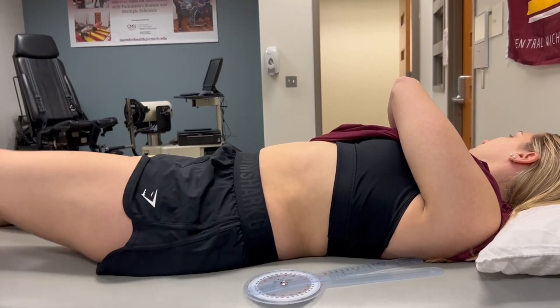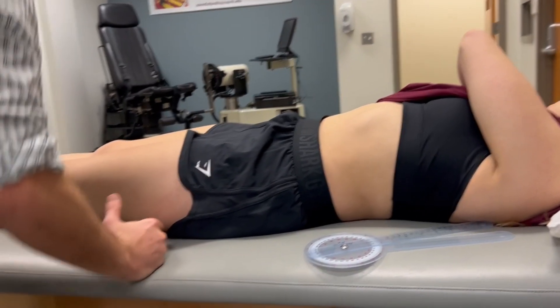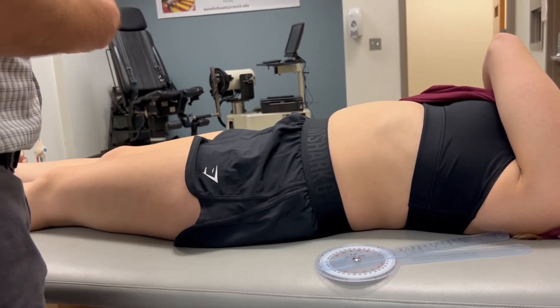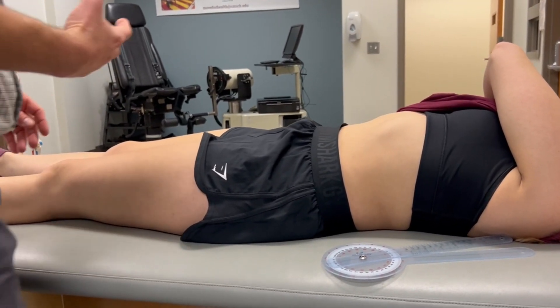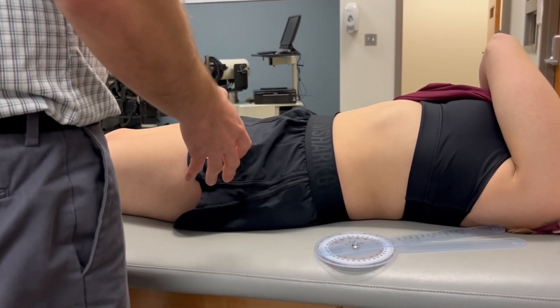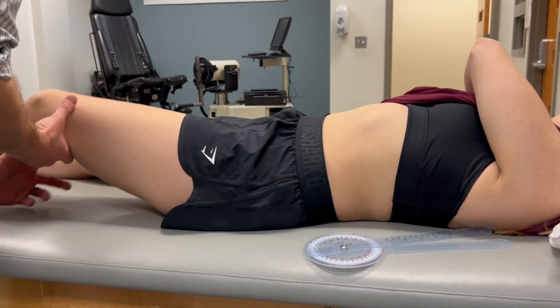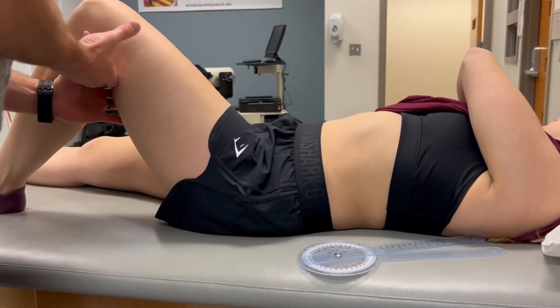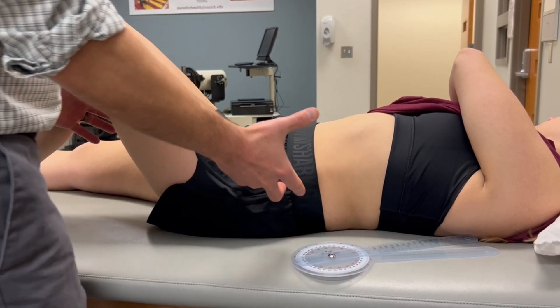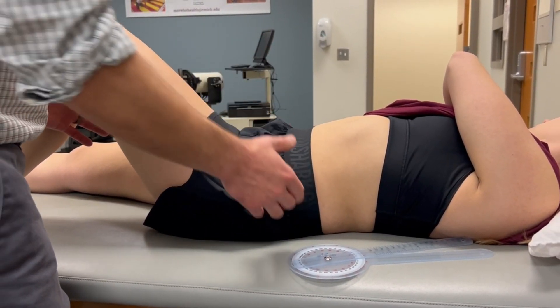Let's also measure this passively. With the shoulder, we talked about monitoring for excessive movement of the scapula or substitutions from the scapula — we have to treat the pelvis the same way. So when we're measuring hip flexion range of motion, one of the substitutions can be excessive posterior tilting of the pelvis.